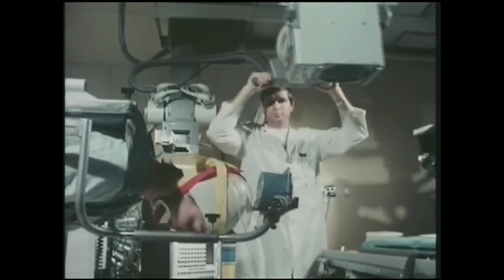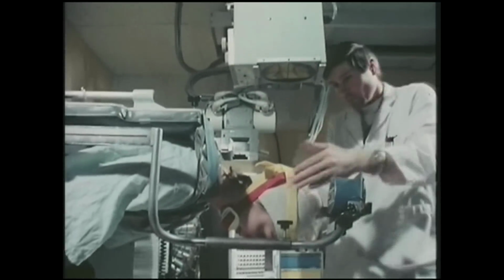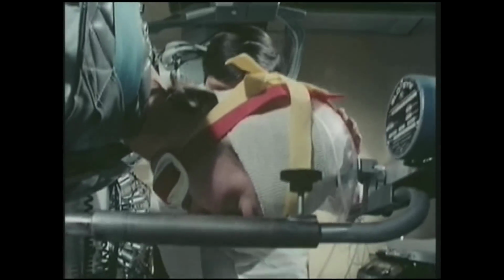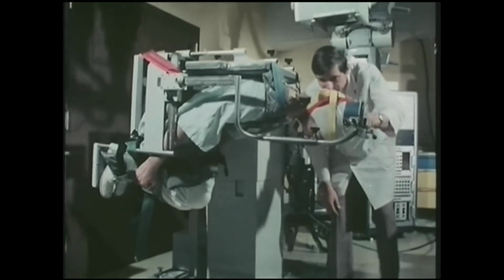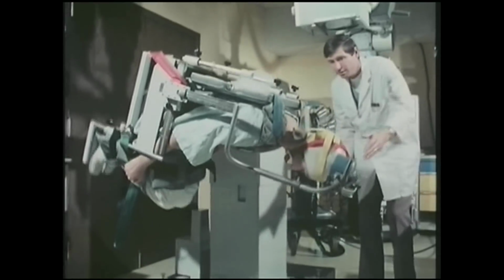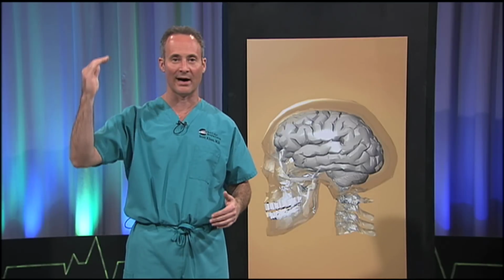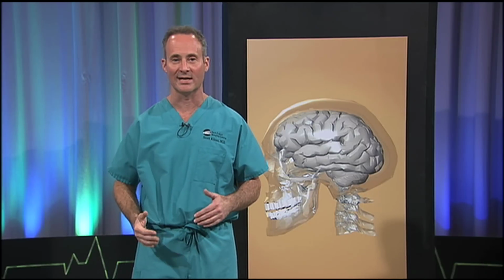Because it was so painful and so nauseating during this process of moving the patient upside down and backwards and forward, they were usually throwing up all over themselves. So if CT scanning did nothing but replace the pneumoencephalogram, it would have been an absolute existential leap in medical care. But today, we can image the whole body, from the top of your head all the way down to your toes.